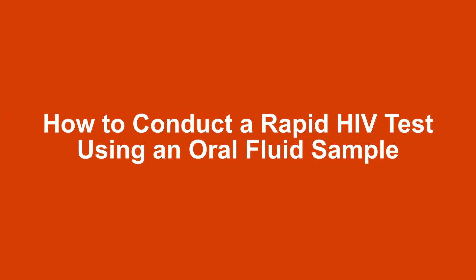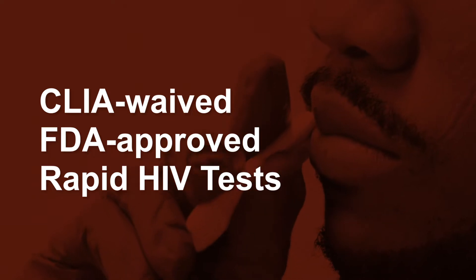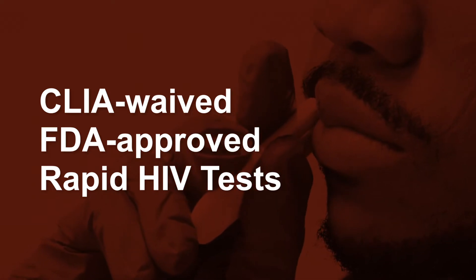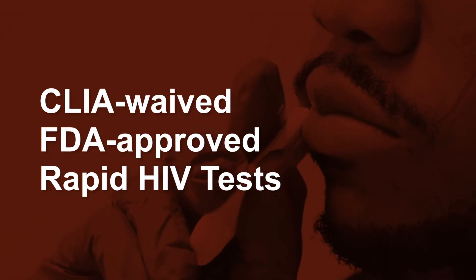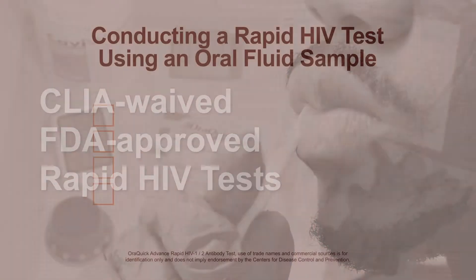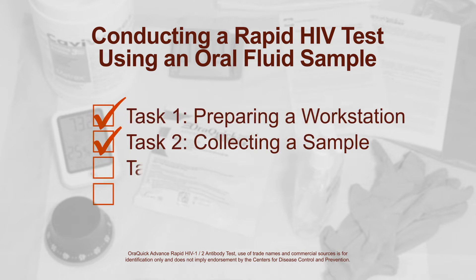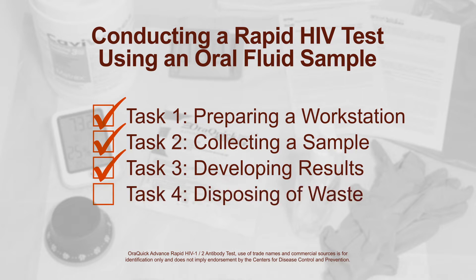In this video, we cover how to conduct a rapid HIV test using an oral fluid sample. Testing sites can choose from multiple CLIA-waived, FDA-approved rapid HIV test brands on the market in the United States. These tests each follow the same four general tasks: we prepare the workstation, collect the client's sample, develop the results, and properly dispose of the used test kit and materials.